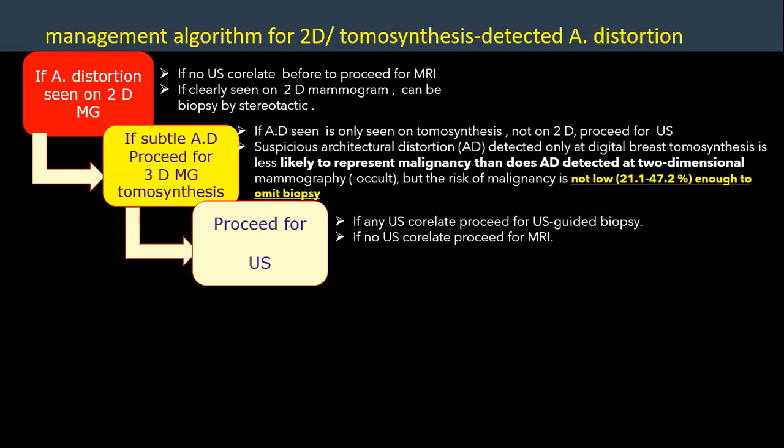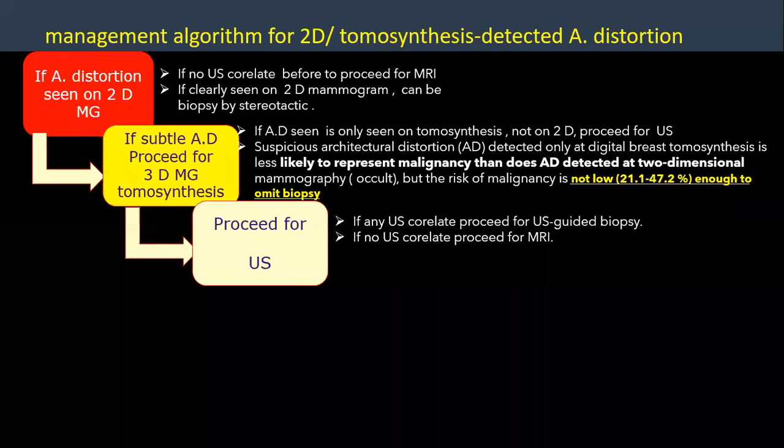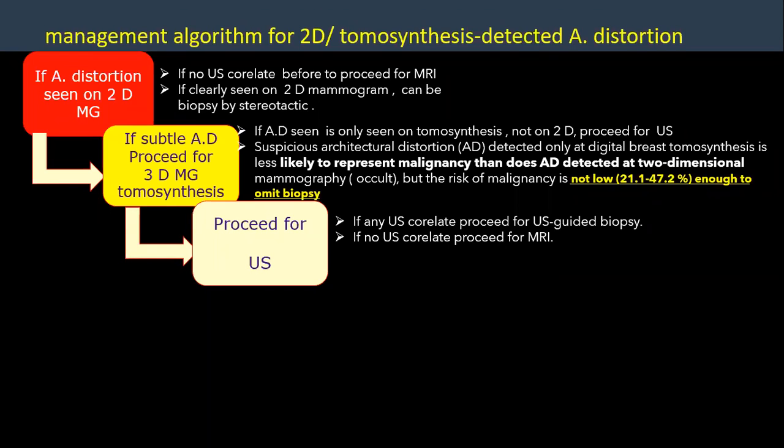Why? If you can detect a lesion at the site of the abnormality sonographically, you can use it as guidance for biopsy.